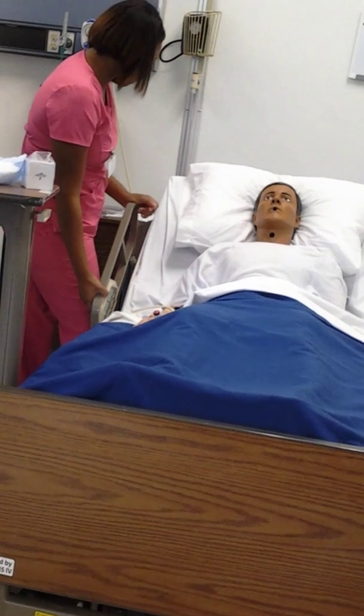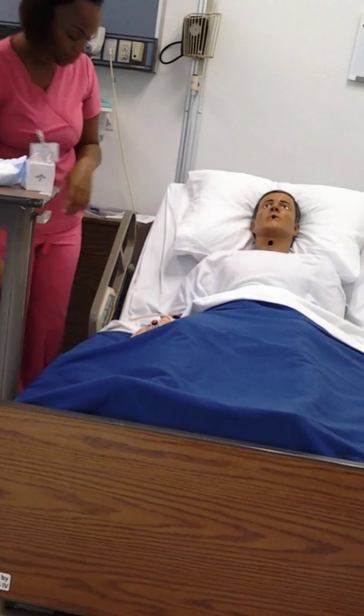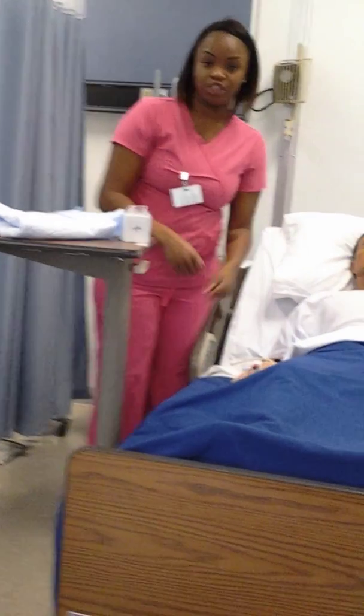So the bed is down. Equipment is off. Wash my hands. Put the call light in reach. Open back up the curtains. And we're done.